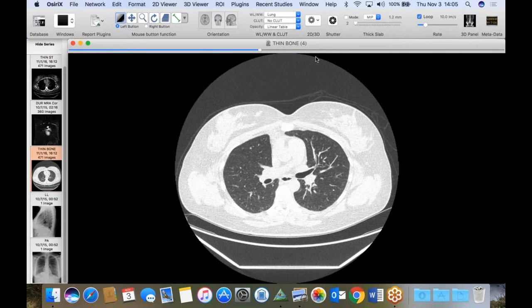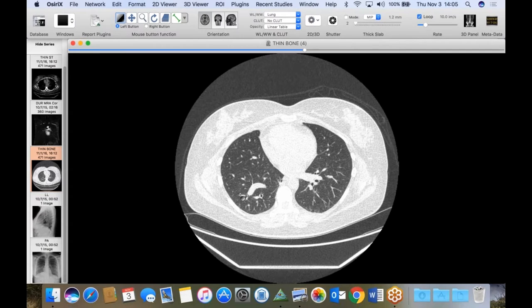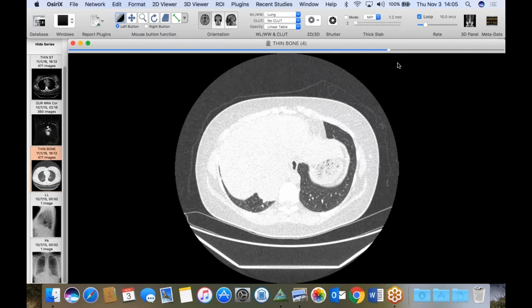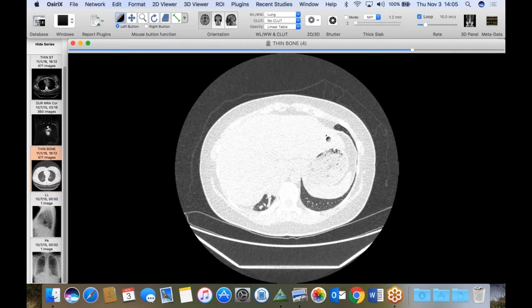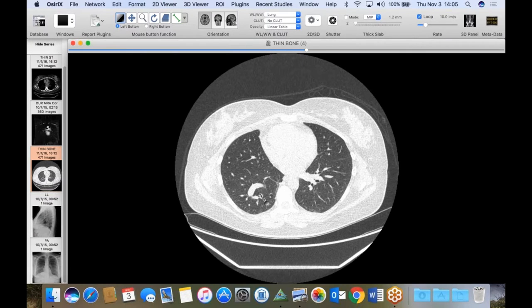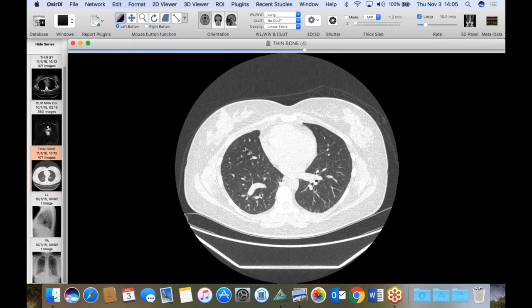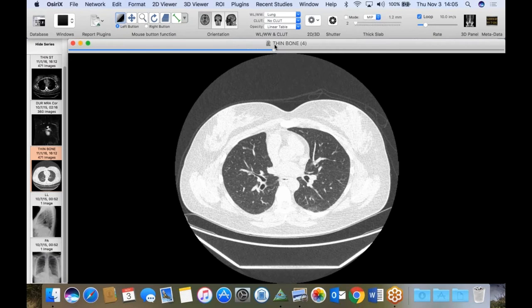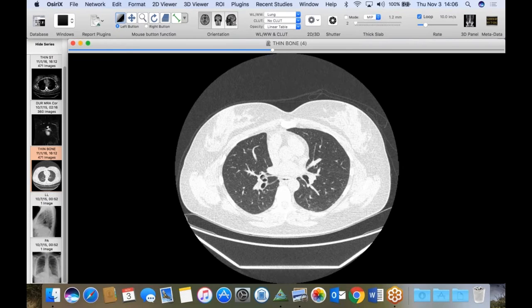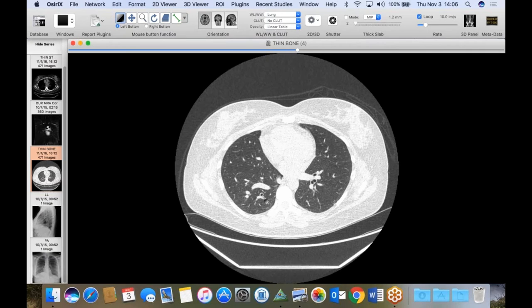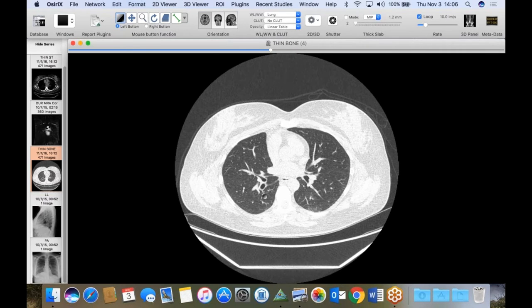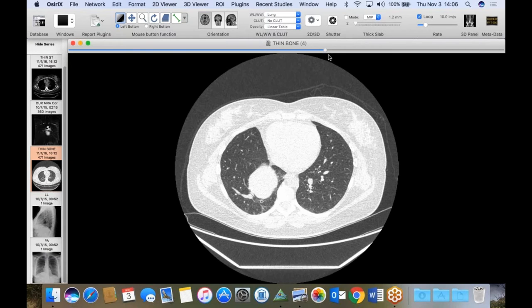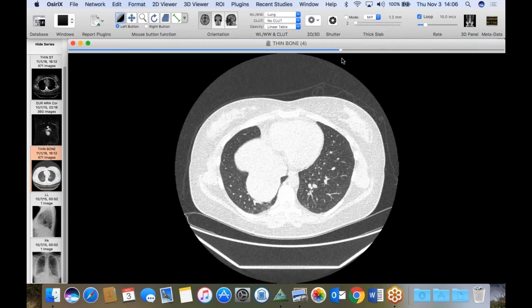What caught my attention when looking at this scan was a funny-looking vein - dilated and tortuous in the right lower lobe - that comes off the left atrium. At the bottom, there are very odd-looking pulmonary vessels, almost like dilated vessels. This airway also caught my attention - it looks normal in the absence of other airways. The right lung is hypoplastic. There's a right upper lobe, then a bronchus intermedius, then what looks like a middle and lower lobe but without a separate fissure. So it looks like a bilobed right lung with an anomalous vein that does drain to the atrium.